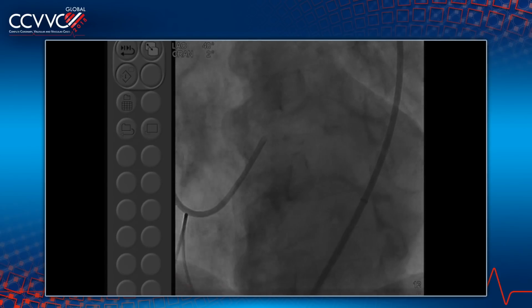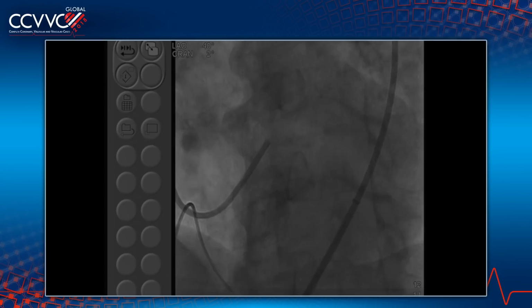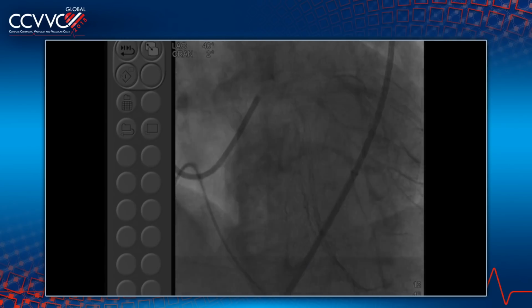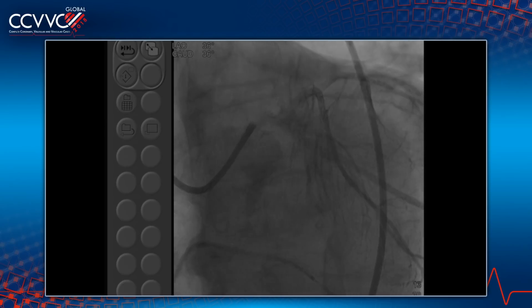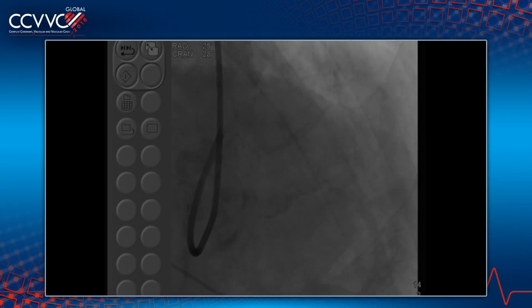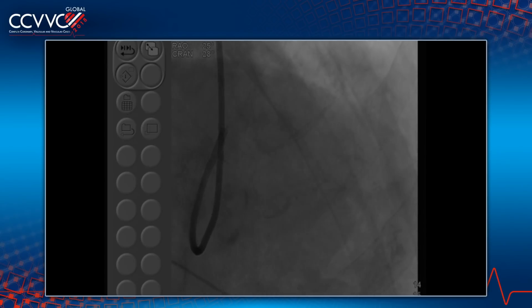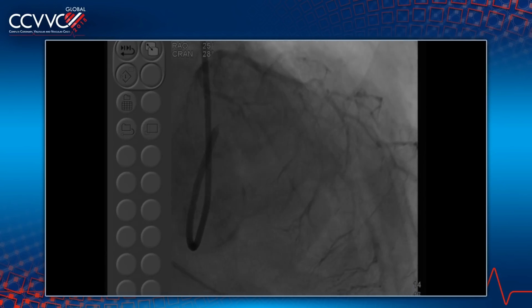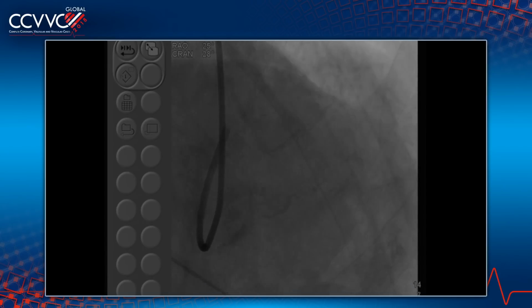Go back to the angiogram again. Very significant trifurcating left main. Can you show us another view? One more view. Good. Very calcific chunk at the distal left main. Make the angiogram big, please. A 1-1-1 trifurcation, and you see here, this is the money shot. Classical 1-1-1, very calcific in this 94-year-old patient.